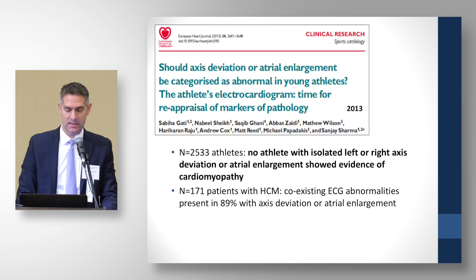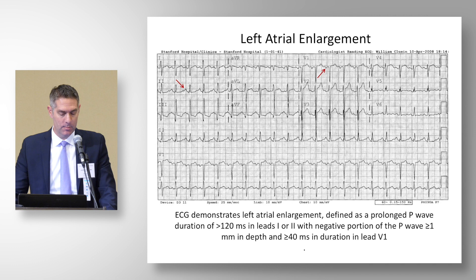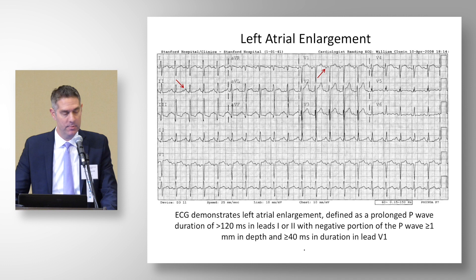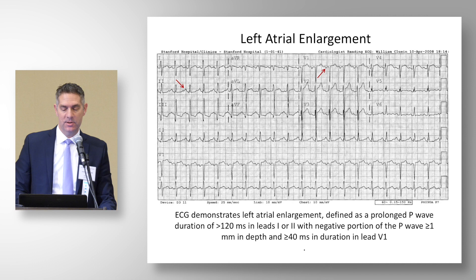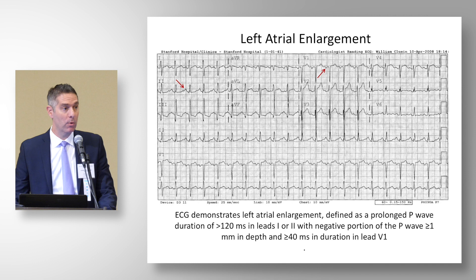This is an example of left atrial enlargement. In lead two, the P wave is greater than 120 milliseconds or three small boxes, and in V1 there's a negative portion of the P wave greater than one millimeter in depth and more than 40 milliseconds in duration. Many people over-call left atrial enlargement by looking only at V1. Our criteria requires both: the wide P wave in lead one or two and the negative portion in V1.